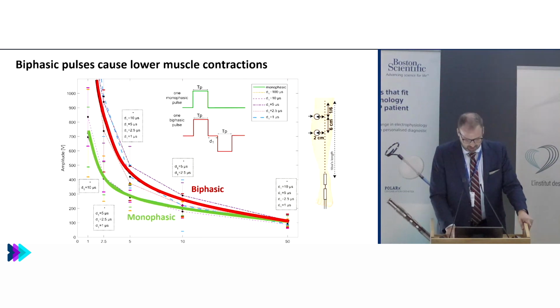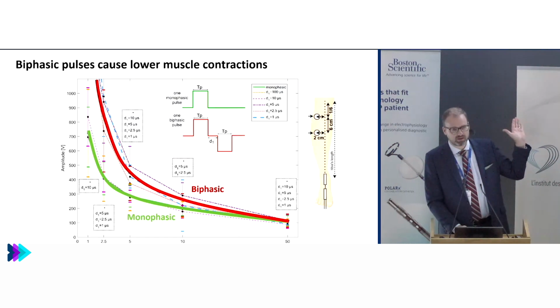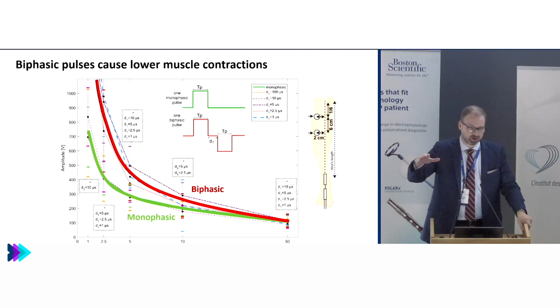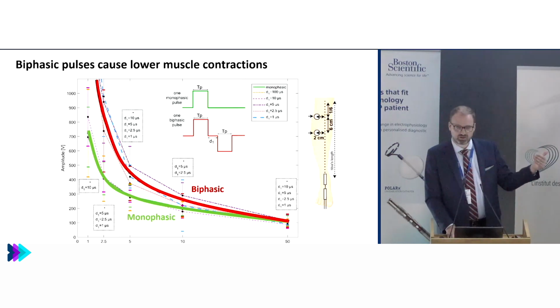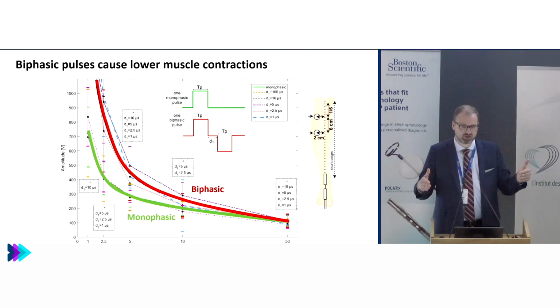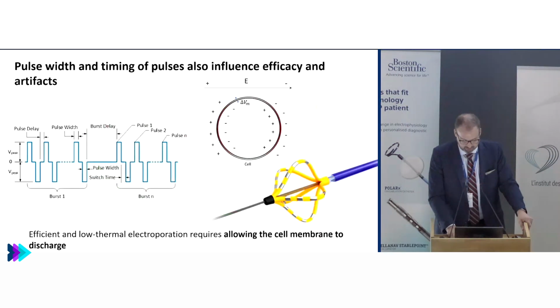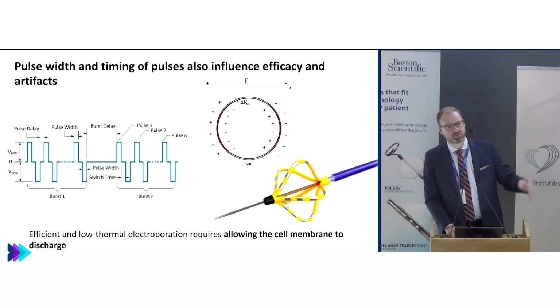That's interesting. So the biphasic pulses allow you to avoid more skeletal muscle capture, partly because you're avoiding the neuromuscular, the actual nerve transmission and the signals, by reversing them. So that's obviously useful, but actually it's harmful for PFA. It makes it less efficient to disturb the cell wall. So we had to double the voltage, and you still had a benefit from that. That's one little insight. The rest of this, again, is to get rid of the bad things we don't want to have happen.